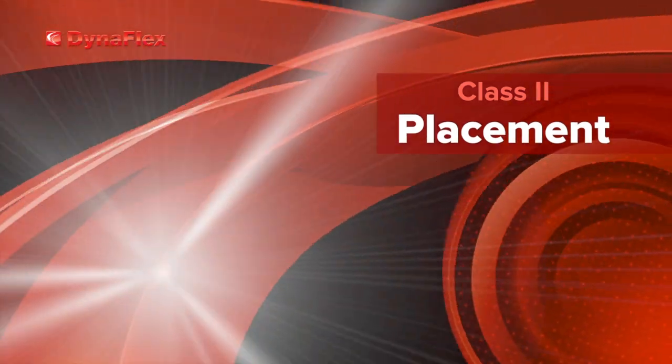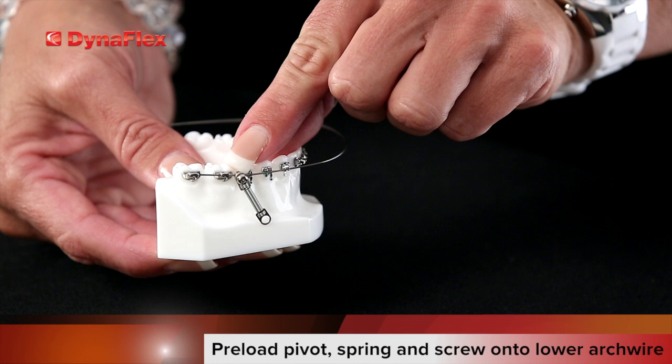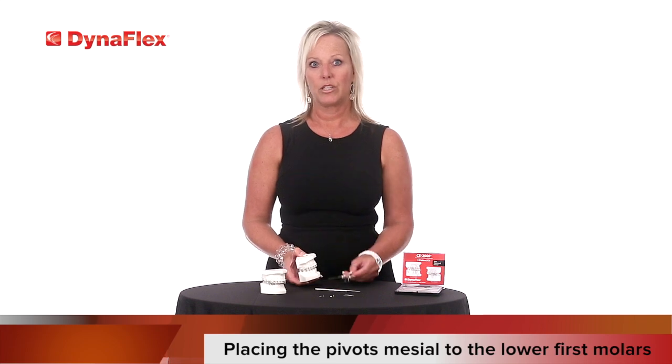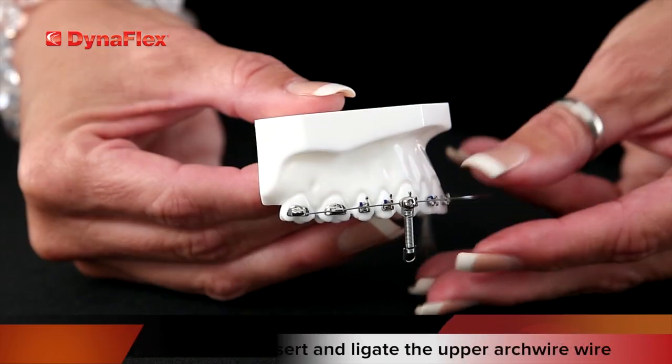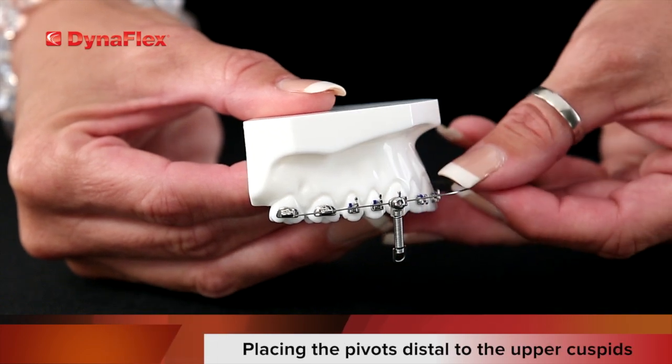Similar steps are used with the class 2 setup. However, you will start with the pivot, spring, and screw combination preloaded onto the lower arch wire. Ligate into place, placing the pivots mesial to the lower first molars. On the upper arch wire, insert and ligate, placing the pivots distal to the upper cuspids.